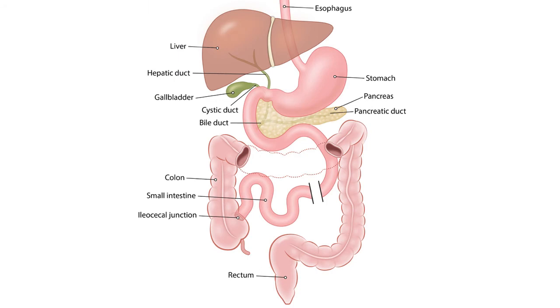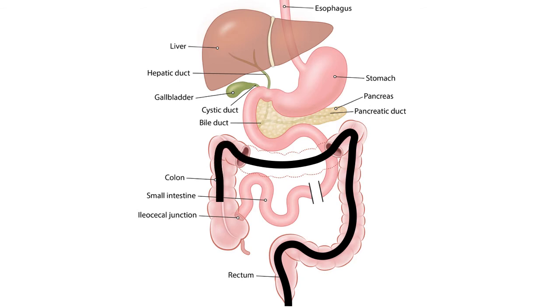And when it comes to the colonoscopy, it is inserted from the anal canal. It goes up the anal canal through the rectum, sigmoid colon, descending colon, splenic flexure, transverse colon, hepatic flexure, ascending colon, cecum. That is where the opening of the appendix is and also the opening of the small intestine or the ileum. With the colonoscope, you can also enter the ileum. So, you can see a lot of stuff in the colon and also treat any problems in the colon.